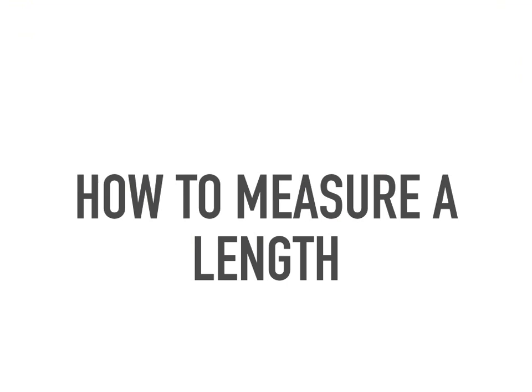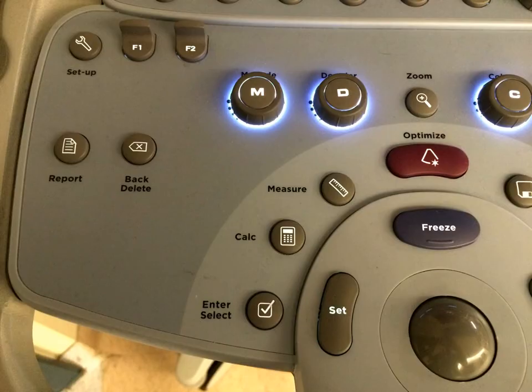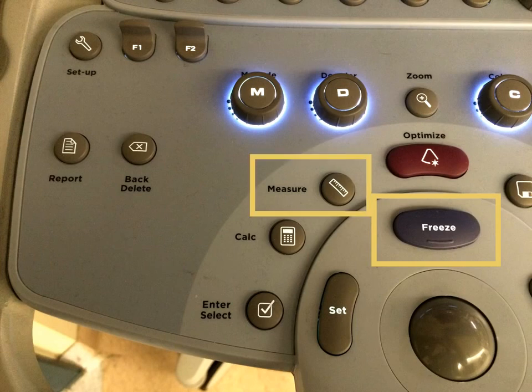How to measure a length. Step 1, tap the Freeze button. Step 2, tap the Measure button. This will place one set of crosshairs on the screen that you can move around with the trackball. There will be a number in centimeters in the lower right side of the screen. This is showing you how far the set of crosshairs is from the probe surface.